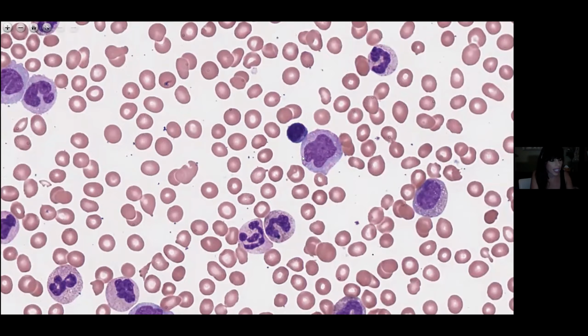This is a lymphocyte here. It is a small round nucleus with darkly clumped and coarse chromatin. And we can compare the nucleus of this lymph to our RBCs and get a general idea about the size.